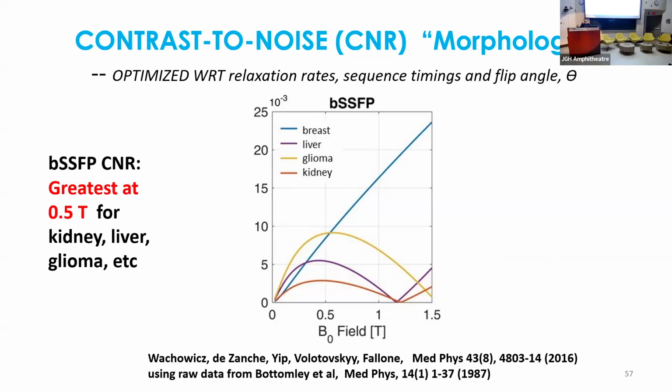Most medical physicists and MR specialists will tell you the signal-to-noise ratio goes up with the magnetic field, which is the same as saying the higher the magnetic field, the less noise. However, SNR is not the only determinant of the quality of an image. There's also something called contrast to noise.